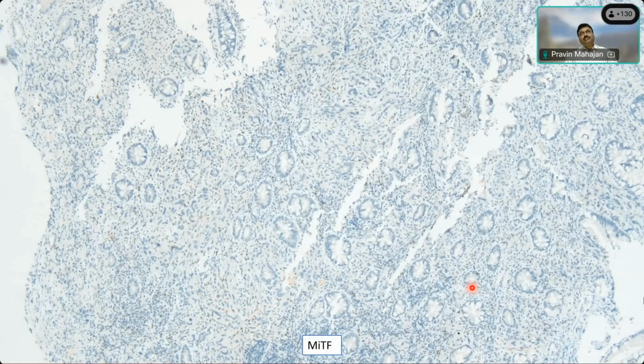Can it still be melanoma? Unlikely, less likely. Okay, let's see. Anybody else want to take a call? Yes, Vaishnavi says amelanotic melanoma. Can it be negative? Kushi, I don't have experience with PRAME, but yes, PRAME can be positive.